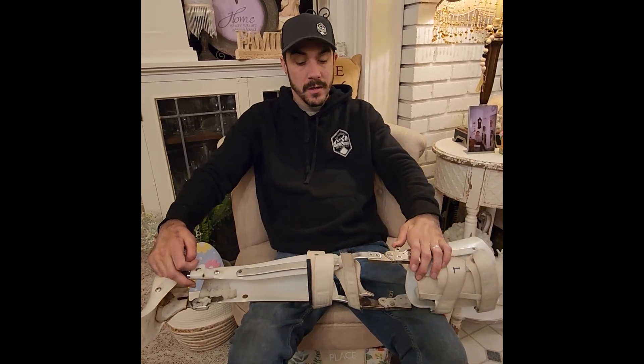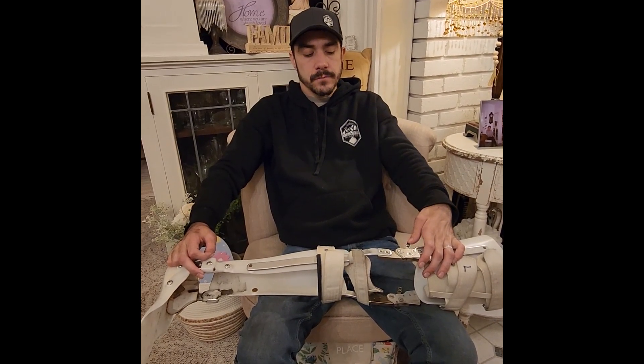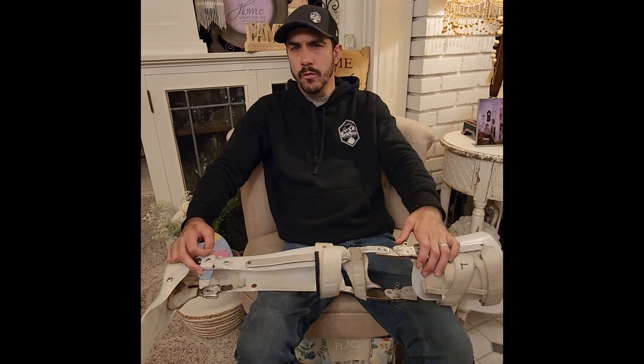Like I said, these have been used and abused for the past 11 years, but they got the job done. These braces are called KAFO braces, and I got them through my local orthotics.